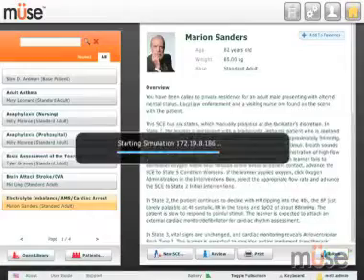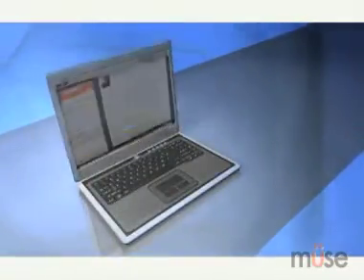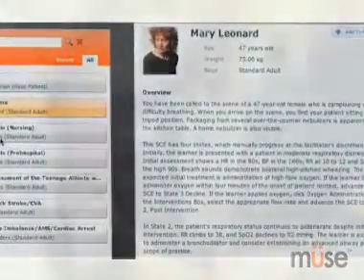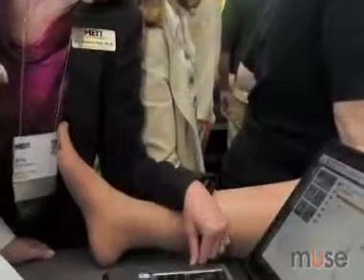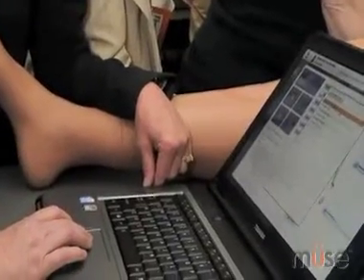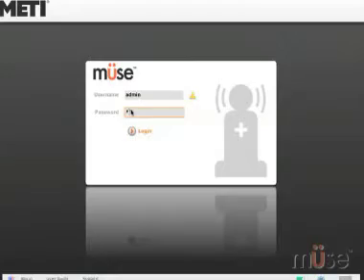Let's get started. The first thing you need to know about MUSE is that because it's a web-based application, you can use any PC or Mac computer and connect directly to your METI simulator, whether you're in the same room or in another location. At the login screen, enter your password. Now, you're connected.